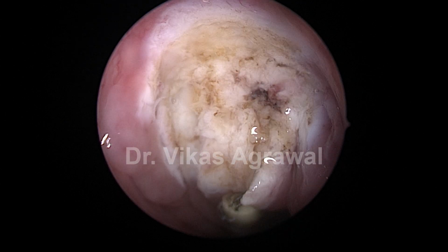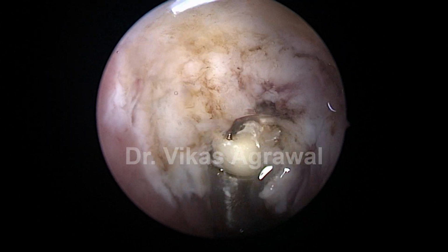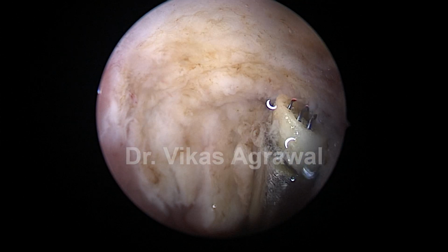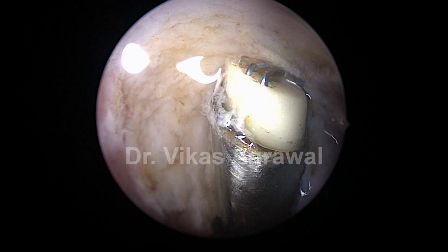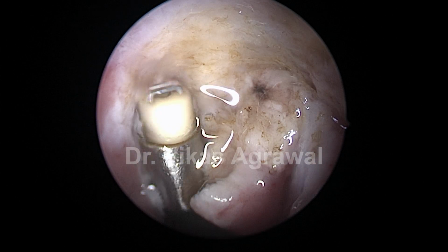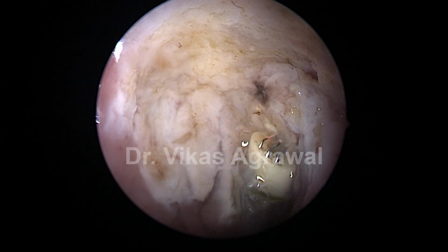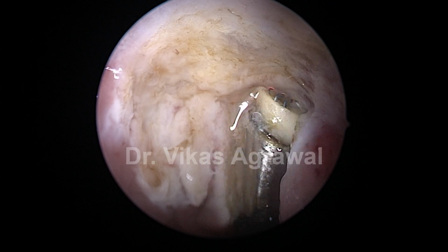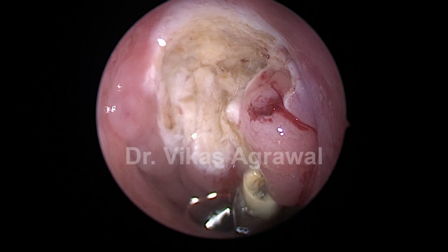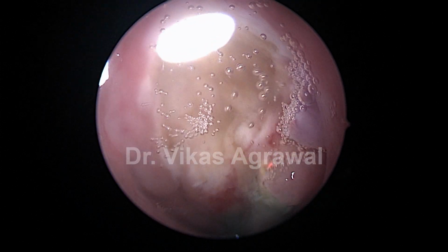Now, as we have some space for the movement of the wand, we are now defining the whole superior boundary first, which is the periosteum below the sphenoid bone. Not leaving behind any lymphoid tissue on that, for a chance of recurrence. And still a lot of scope for debulking first so that I can define the rest of the boundaries.